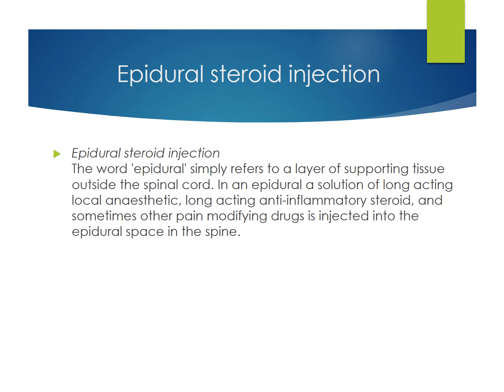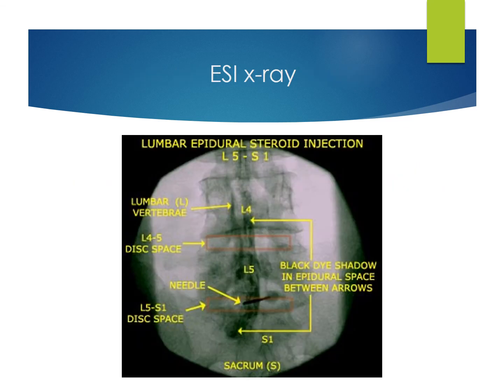Epidural steroid injection. The word epidural simply refers to the layer supporting the tissue outside the spinal cord. In an epidural, a solution of long-acting local anesthetic, a long-acting anti-inflammatory steroid, and sometimes other pain-modifying drugs is injected into the epidural space in the spine. ESI X-ray.